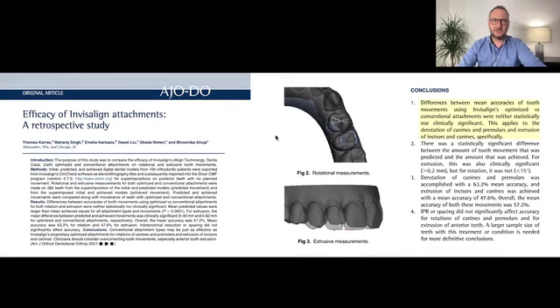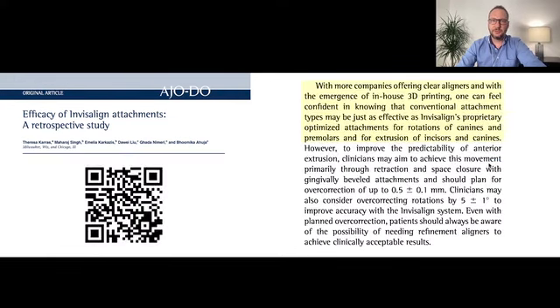So considering efficiency, this article from the American Journal evaluated and compared the difference between optimized versus conventional attachments, okay? And they didn't find statistical differences, okay, between the two. So they are very similar one with the other, okay?